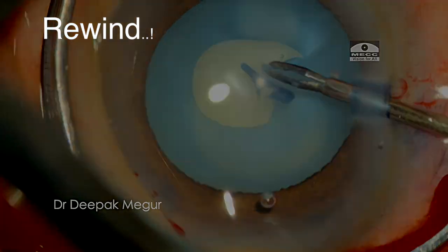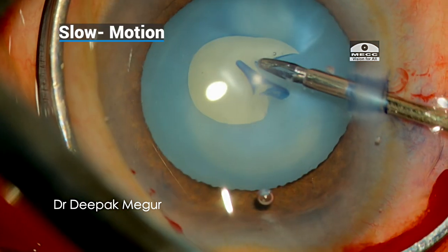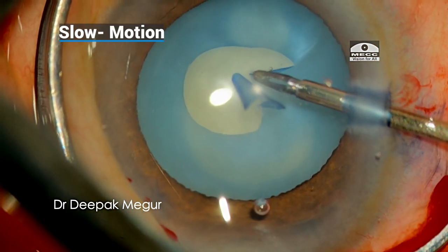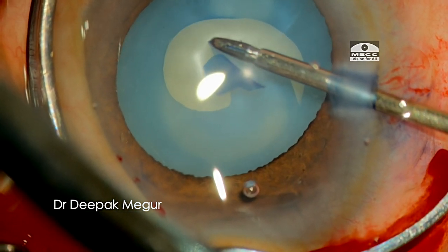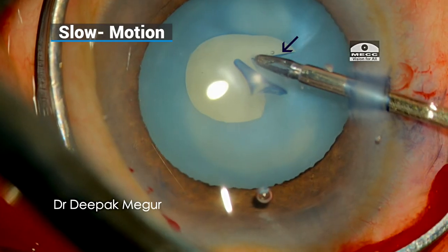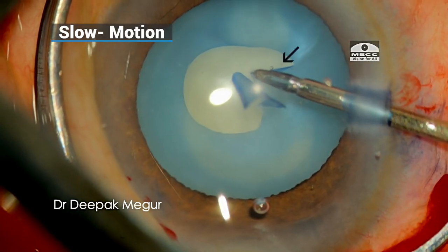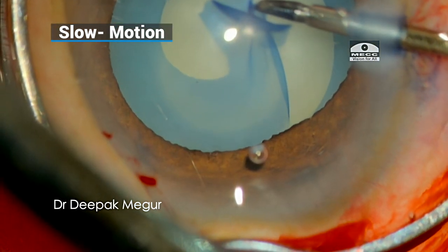Let us rewind and analyze how we could have done better. We can clearly see that the edge of the tear was already heading outwards. My rescue maneuver — the direction of pull — was towards the center and away from the directional tear, which was fine. However, the real issue was that the flap needed to be totally flat; during the rescue maneuver the capsule had folded on itself, which should not have been the case.